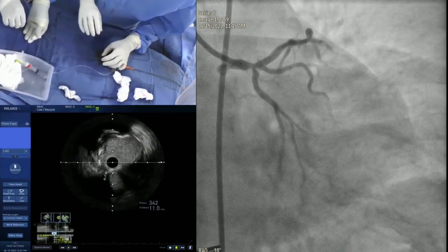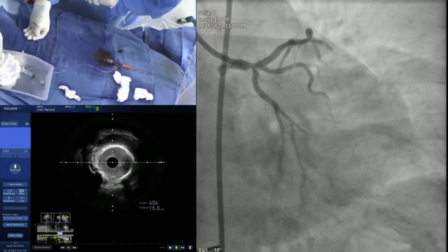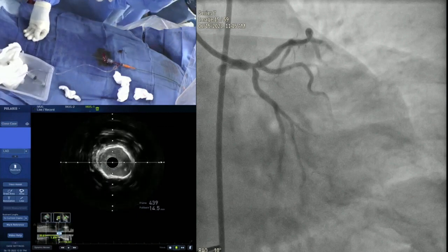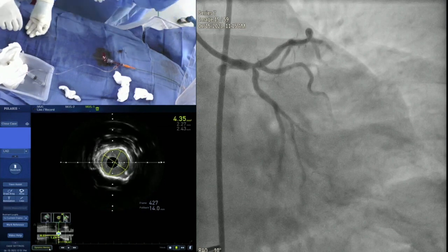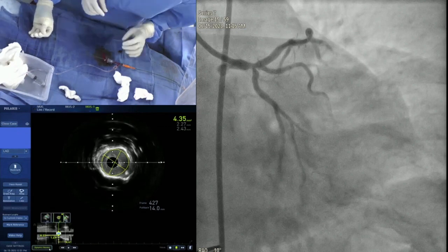Or you think we can just do cutting balloon and proceed? Yeah, Devori wants to do IVL. Anyone else want to do anything or just cutting balloon? Show exactly where the calcium is. Yeah, right here. This is a distal left main 360, but the longitudinal length is just 3 millimeters. I know the arc is more than 180, but the length is not deep.